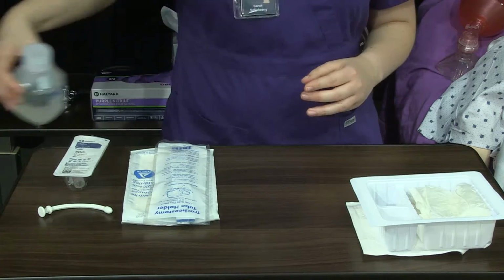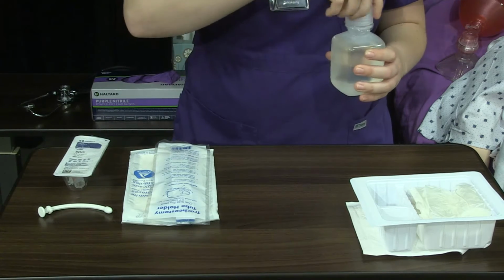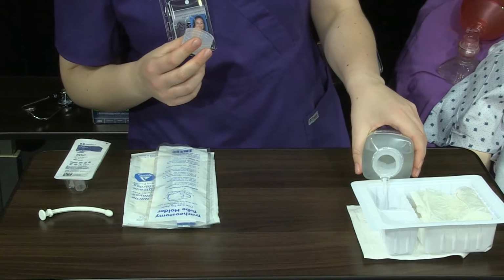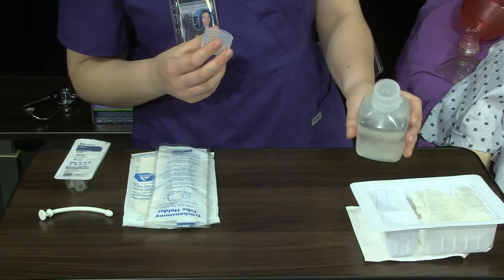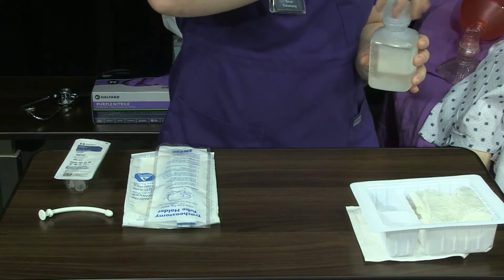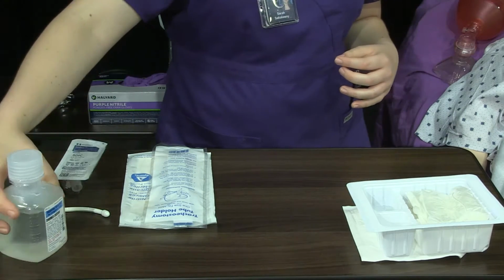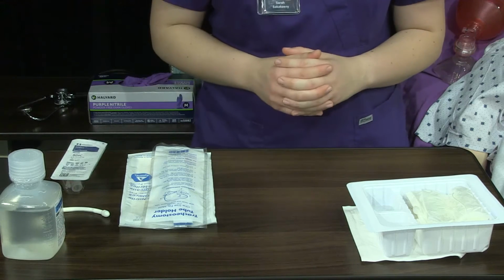Fill sterile saline container with sterile saline. Apply clean gloves.